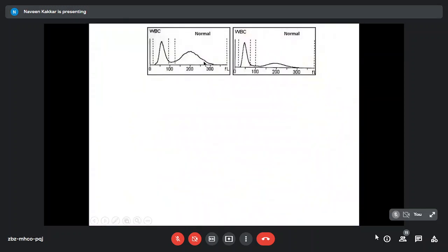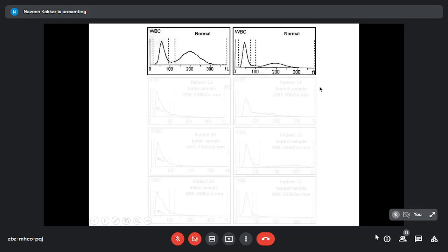Those are normal histograms. In this patient, lymphocytes and granulocytes are almost equal. This patient has more lymphocytes than granulocytes. But I wanted to look at the ascending limb. It's a nice mirror image of the descending limb almost. Sloping rise.